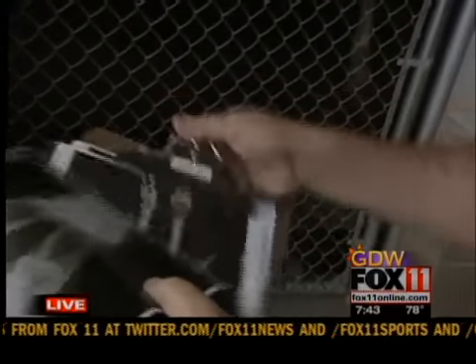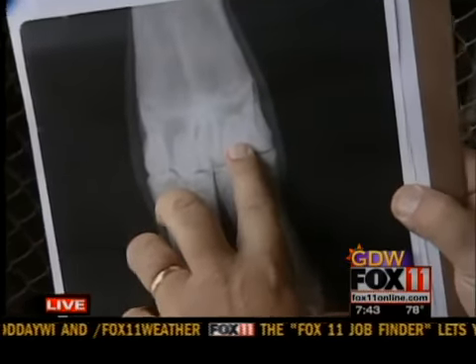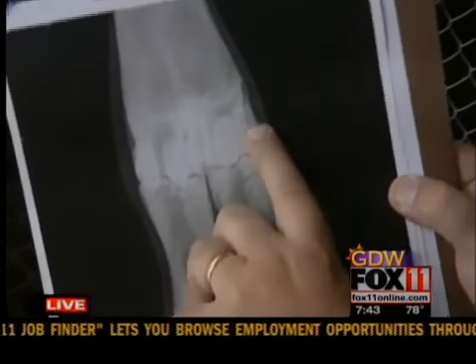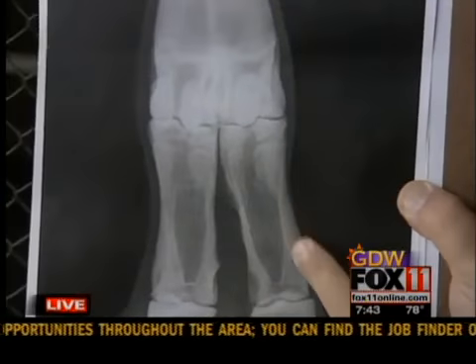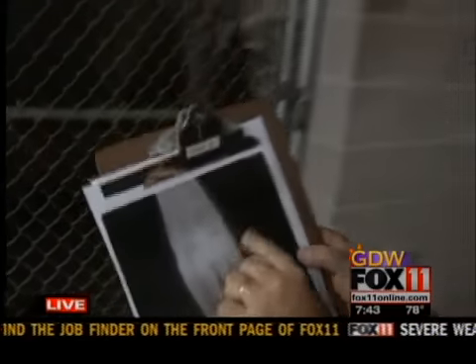Now I'm going to show you the left leg. The left leg, how many do you count? 1, 2, 3. Huh. So she was only born with 3, and she doesn't have one here. So notice you can see down here, the bone along here has come in a little bit, like here. So she's got some destabilizing there. If she was a racing horse, she wouldn't be racing. We're not going to be racing Zuri. So she's going to be fine.